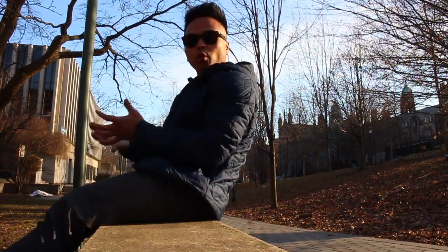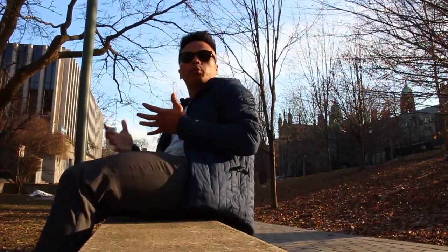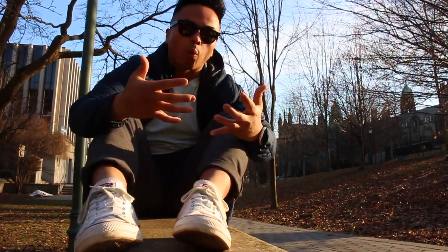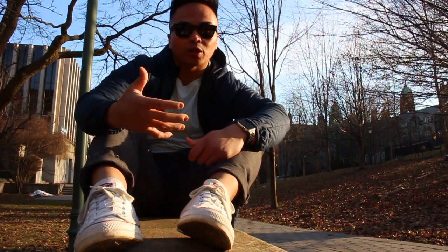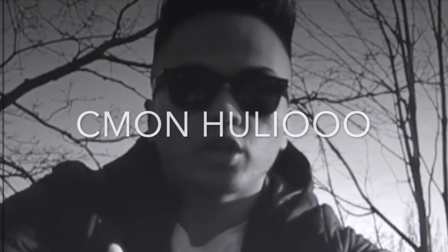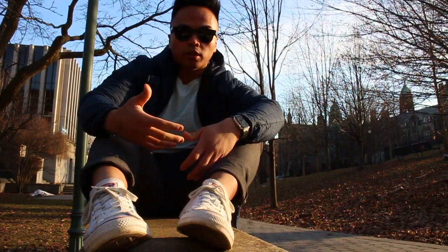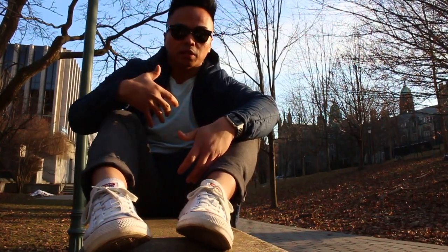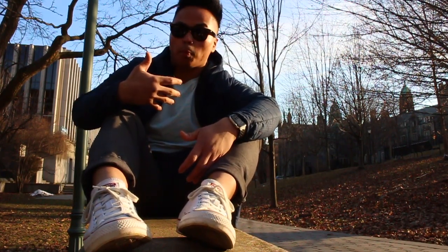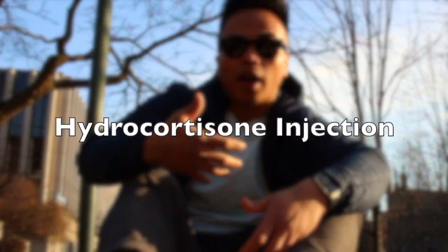The next use for image-guided joint injections is when we need to inject hydrocortisone directly into the joint space. Why would we need to inject hydrocortisone directly into the joint space? For patients with major arthritic changes in the joint spaces, they are in a lot of pain, and sometimes a typical analgesic may not work anymore. Therefore, their family physician can recommend hydrocortisone steroid injections directly in the joint space to alleviate the pain.